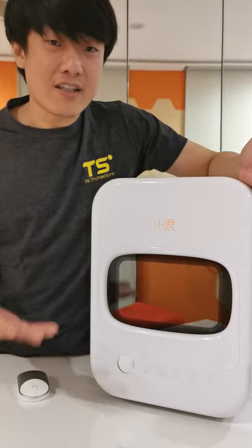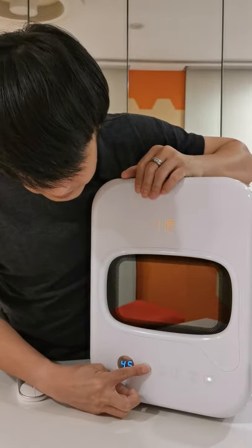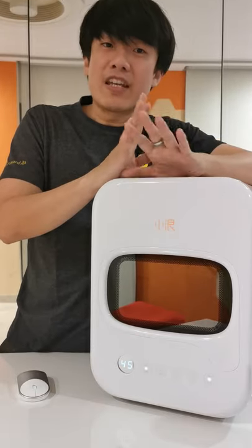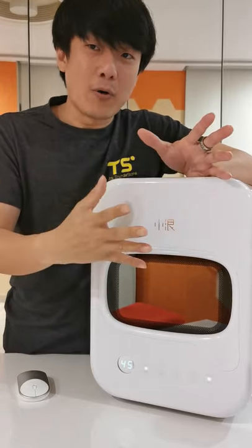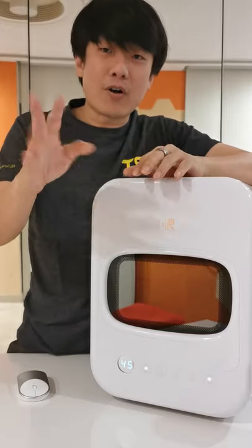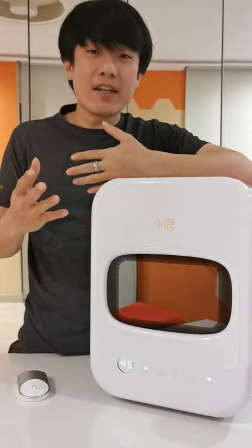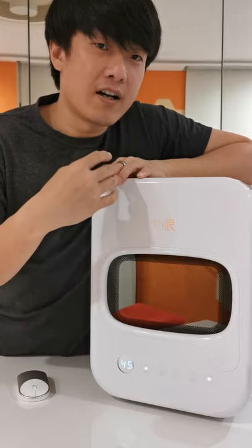The auto mode indicates 45 minutes total. The minute you switch it on and choose auto, it will blink for 5 seconds. After blinking, this is a confirmation time to make sure that you are choosing the correct mode, followed by 30 minutes of heat drying. The heat drying is at 45 to 55 degrees Celsius. Next, it will jump to 10 minutes of UV sterilization mode, followed by a second level of 5 minutes heating mode. Lastly, it will go into storage mode, which will automatically repeat a minimal heating and UV process every 4 hours.